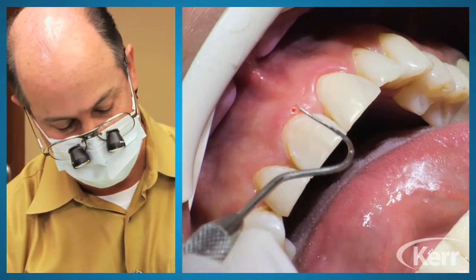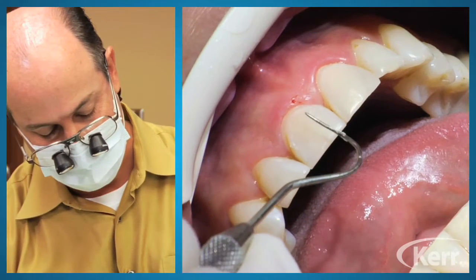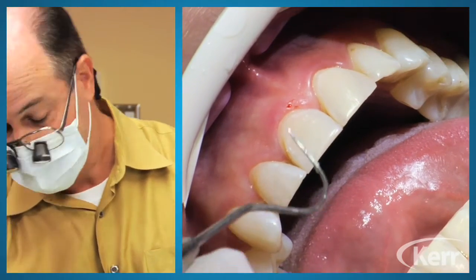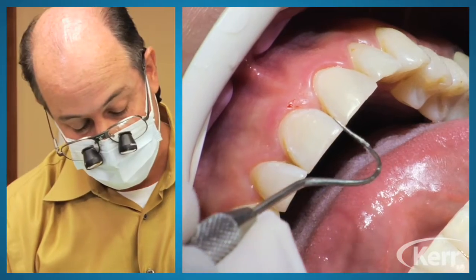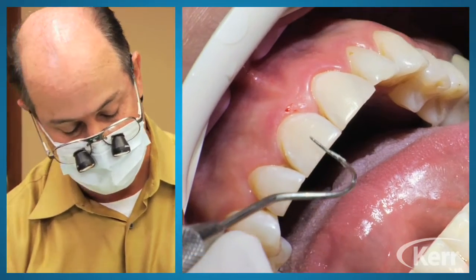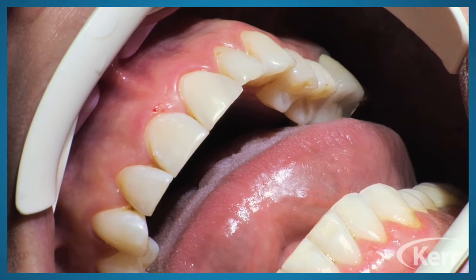And that's the most frustrating thing, if you get the material where you want it and all of a sudden you're pulling the instrument away from the tooth and the material's coming with it. That's very, very frustrating. Once I got the margins where I liked them with the red striped diamond, I took one medium disc, and I don't really care what disc system you use personally, and one fine disc, and that's really the polish that we got on that, which I think most of you consider very adequate.